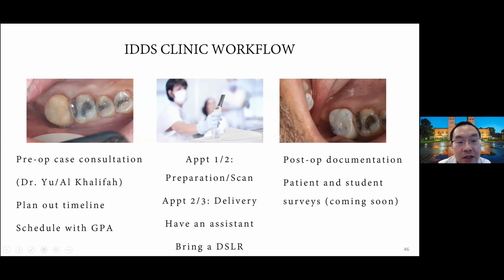We'll also take a look at the existing restoration to see any other clinical considerations, like whether or not it's likely for us to achieve a supragingival margin. All those things we need to consider, and then plan out the timeline for when you want to schedule the patient, and who is going to cover you. Once we have that figured out, you're going to schedule with your GPA, on a Thursday. Right now, we are only doing Thursdays.